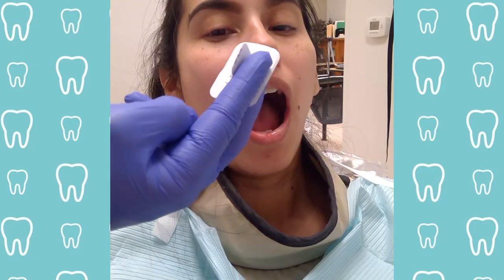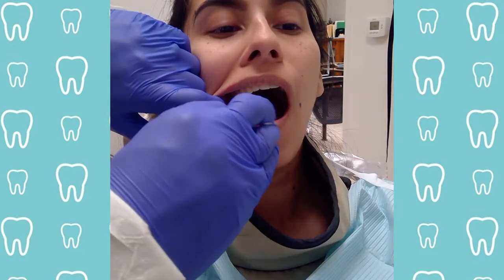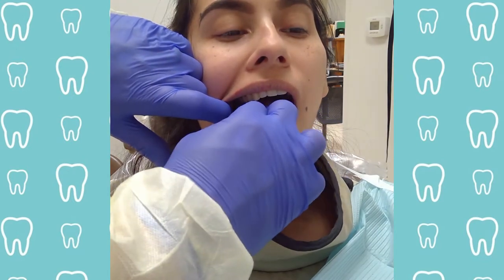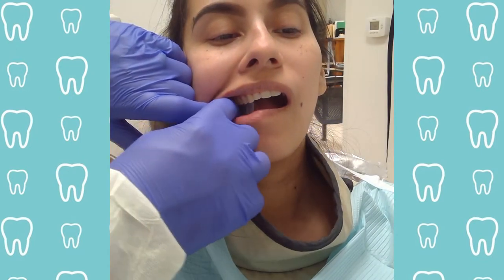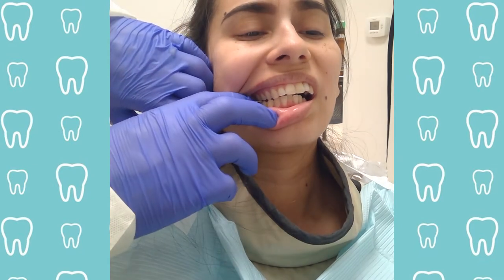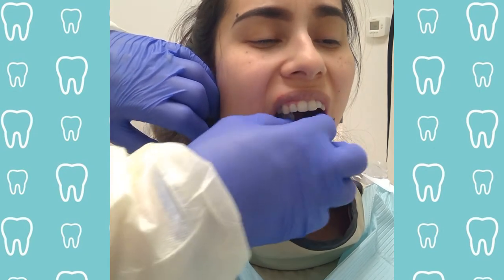For bite wings, my personal technique is to hold the film like a card between my fingers, insert it into the mouth, and hold it down with my index finger to secure it in place as the patient bites down. If it looks painful, roll the x-ray back towards the posterior and then slowly roll it forward so that the pain is lessened.